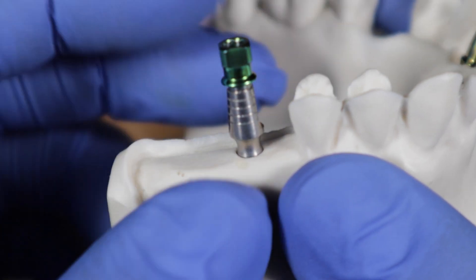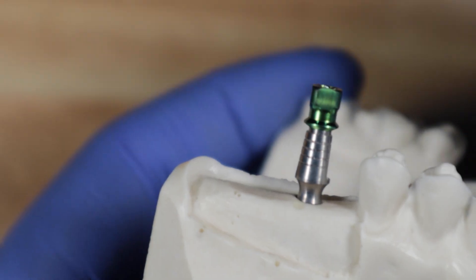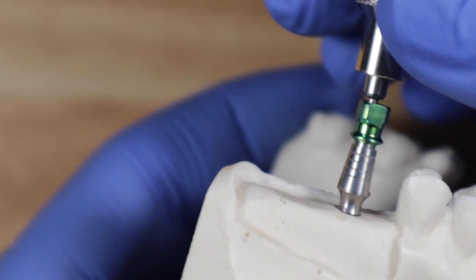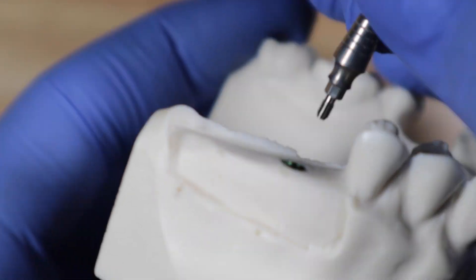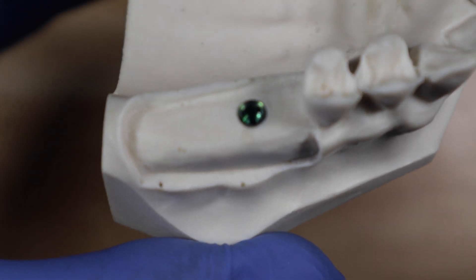Once you confirm that it's all the way down, then you can go ahead and take the transfer off. So you just take the transfer off with your little hand driver. And then you confirm that your implant is all the way down.